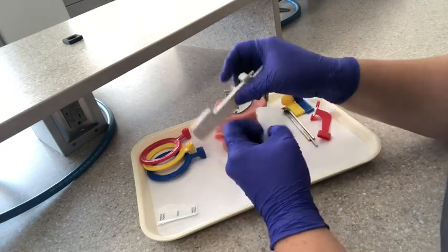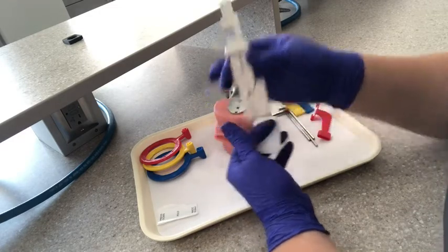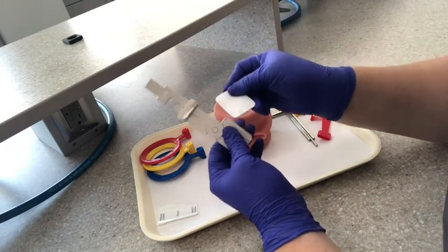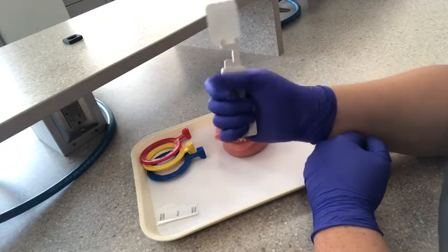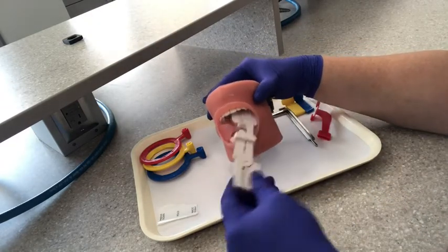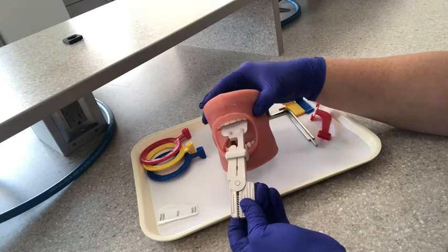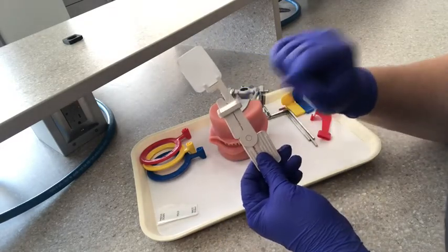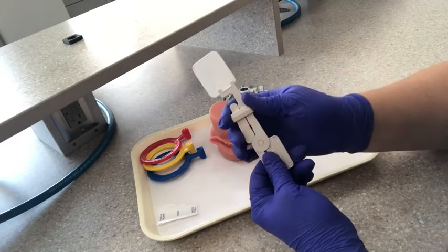The snap array can also be used for anterior. What you would do is take your film out, slide the lock down, and then at the end of this you would find that dot, slide the film in the end, and then your patient would need to hold this as you line up the PID. If you're doing the anterior, you would show them, have them grab the handle, then you would line up your PID and go expose your film. So that's how, in case a patient can't close and they're having a hard time with the XCP, you could use a snap array for anterior.